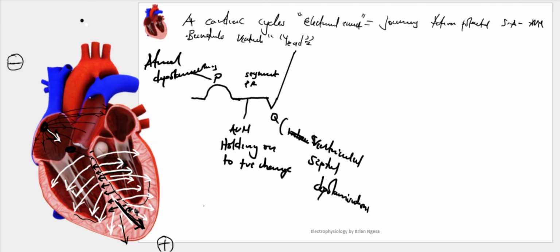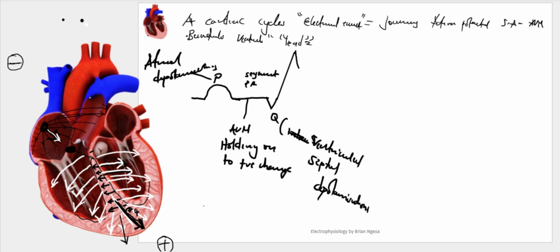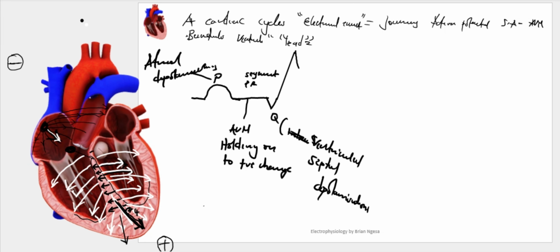This is because, in terms of amplitude, of the big muscles that you expect in the ventricle. So let's just revert it, rub it a little bit. We're going to rub all of it. Let's put it up to the baseline. So this becomes the R wave.